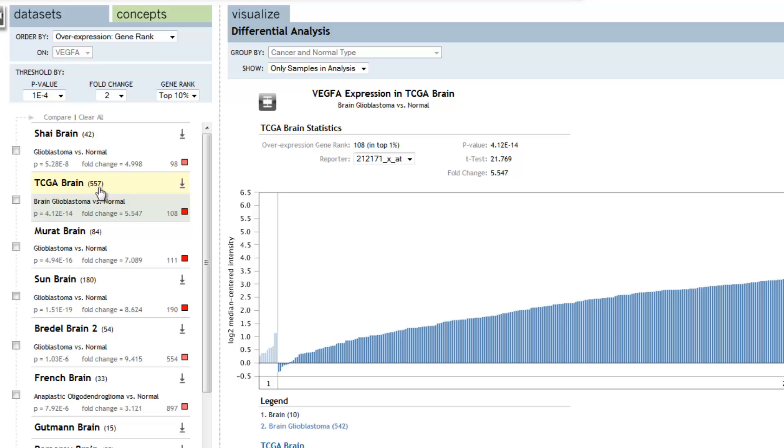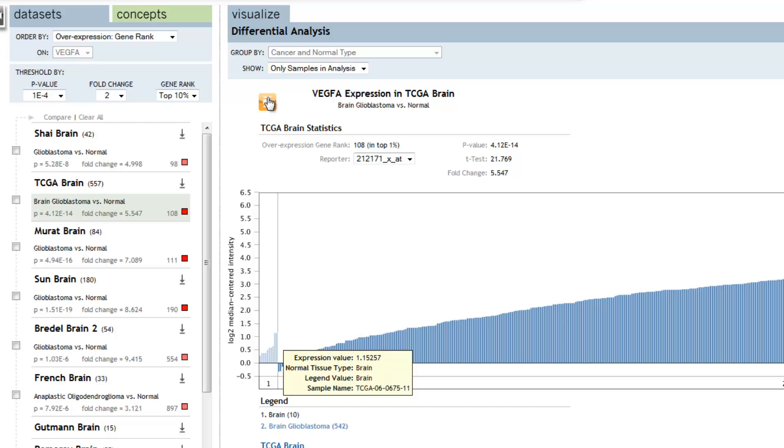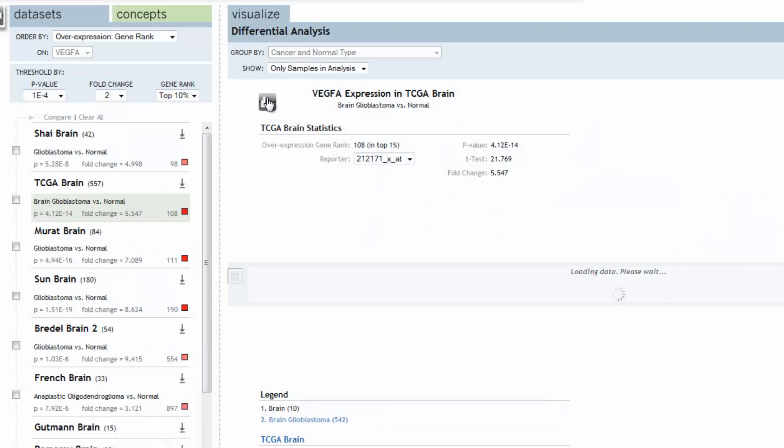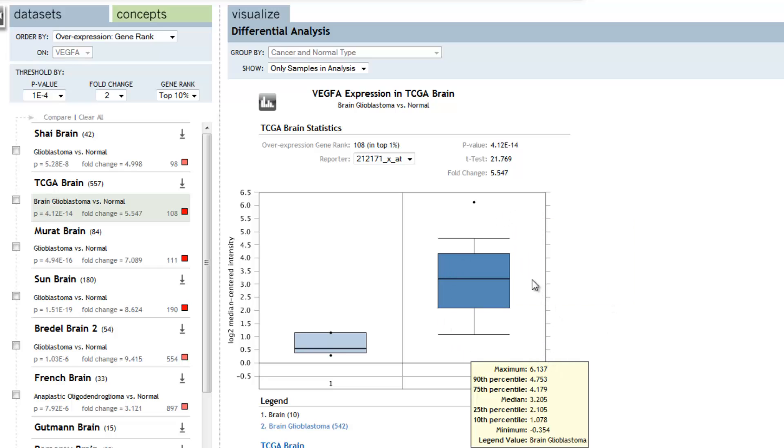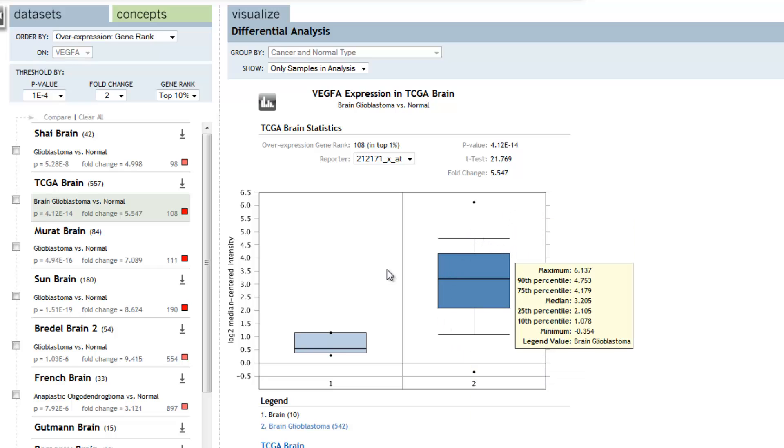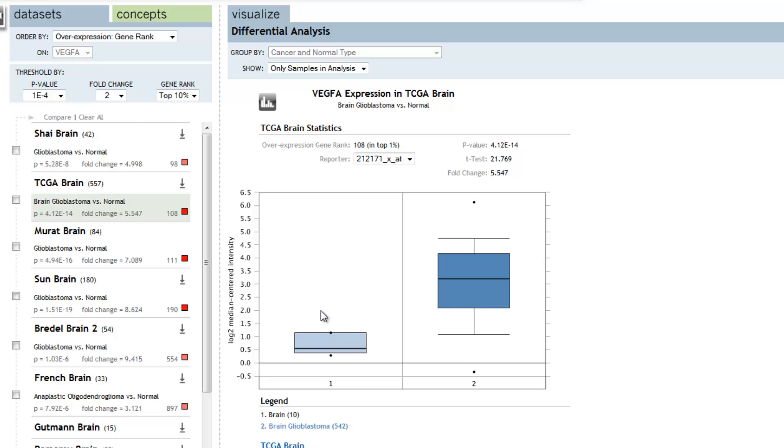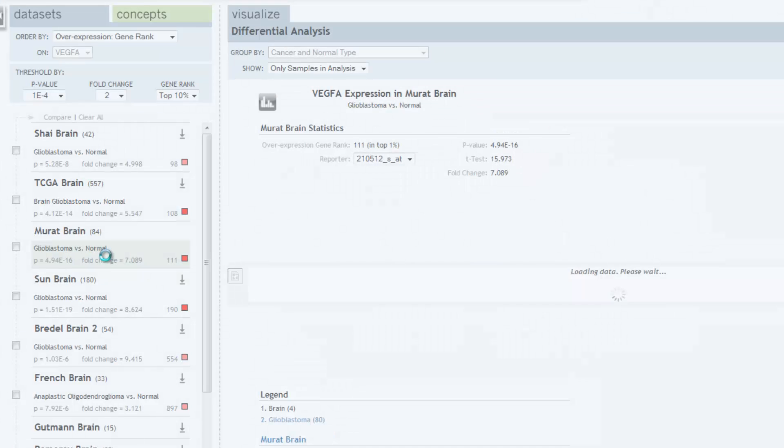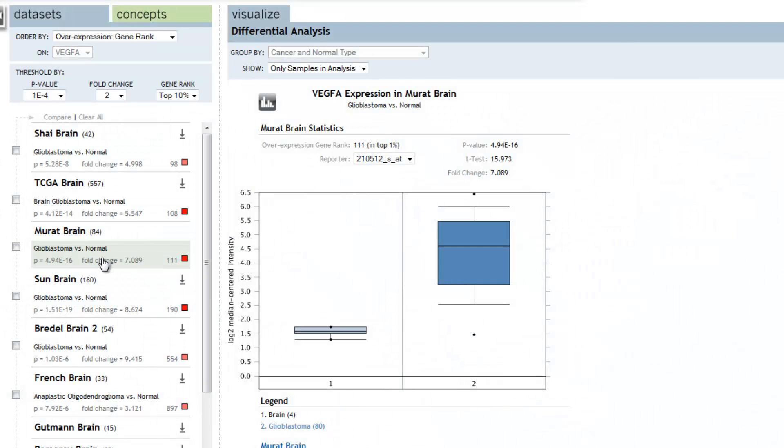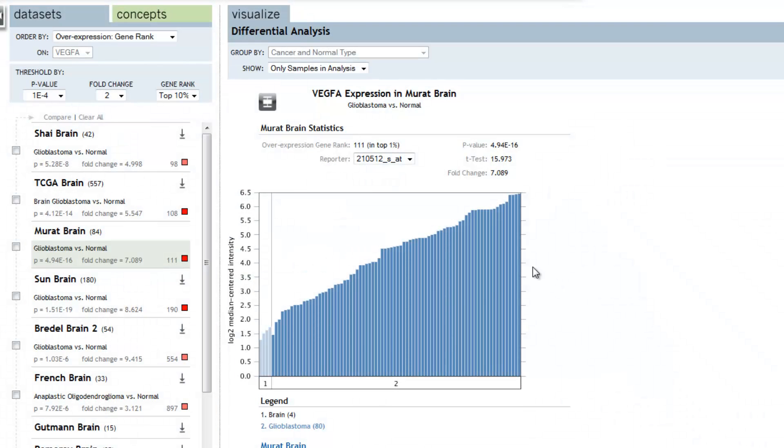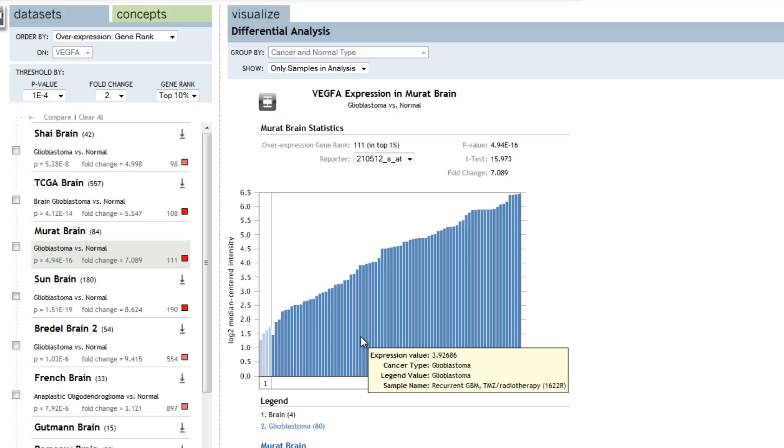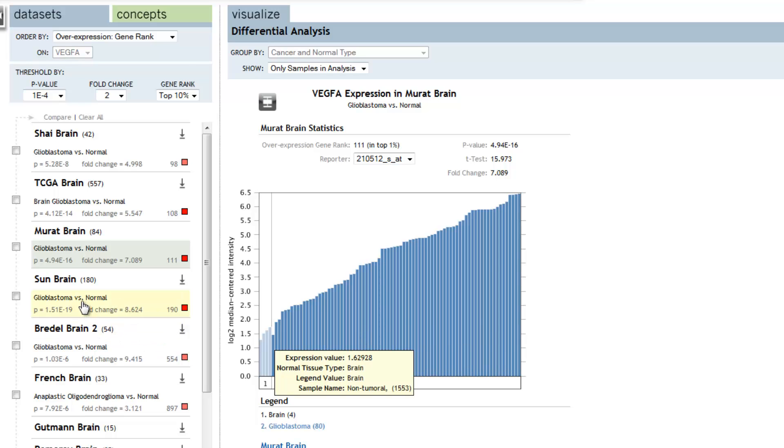The TCGA brain study, nearly over 550 patients are summarized in this plot. And see again the significant p-value fold change in gene rank when comparing 542 brain glioblastomas to 10 normal brain tissues. Similarly, in the Marat brain study, we have glioblastoma relative to normal samples. And we have the drill down in patients when we're comparing glioblastomas relative to normal.